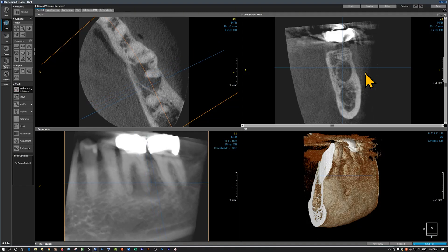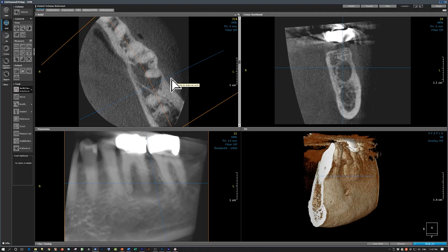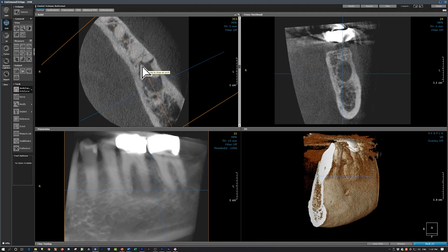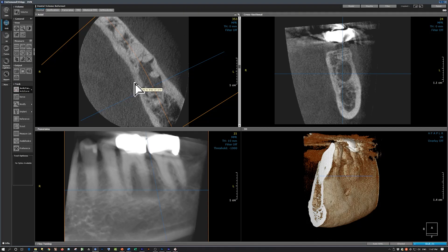Further distally, between the roots of the first and second molar, here is this lesion. This lesion has not disrupted the buccal cortex or the lingual cortical plate. What we see here on the axial view, this lesion is rather linear without expanding the buccal cortical plate or the lingual cortical plate. It has an oval appearance, not circular.